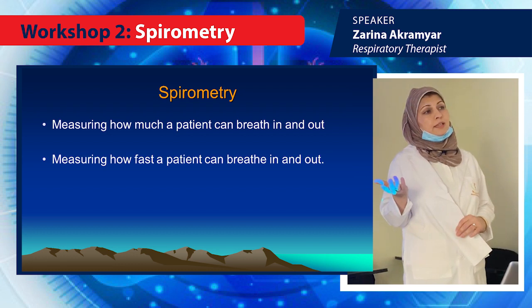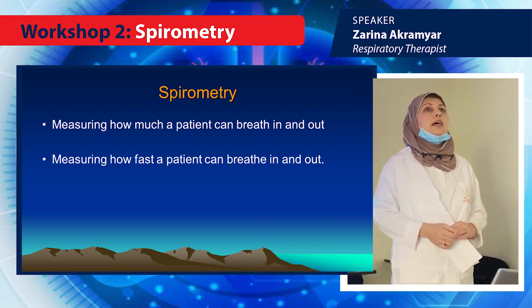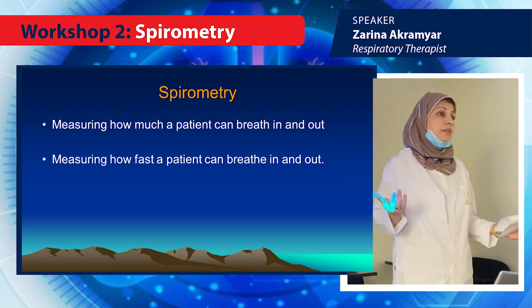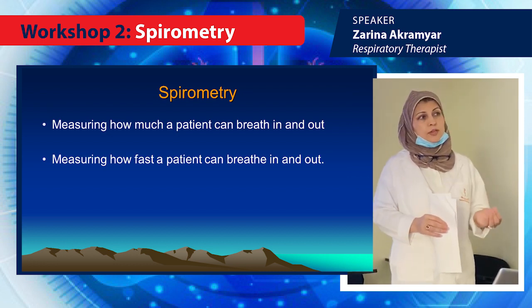To what degree? Is it mild? Is it moderate? Is it severe? The other question, is there any combined disease? Could be more than one. We don't know. All these questions will be answered by spirometry.